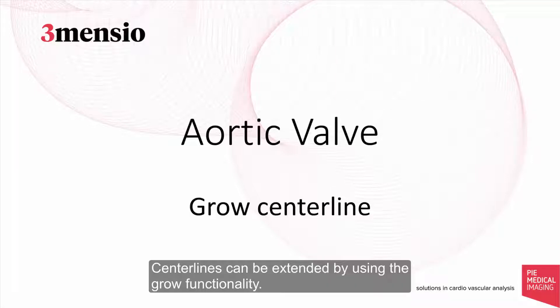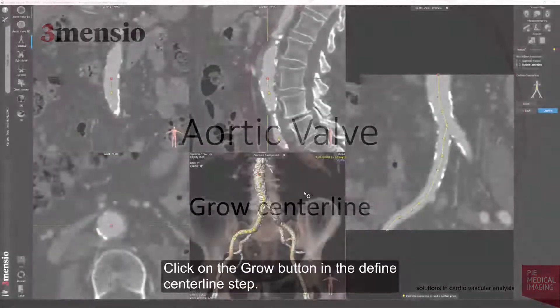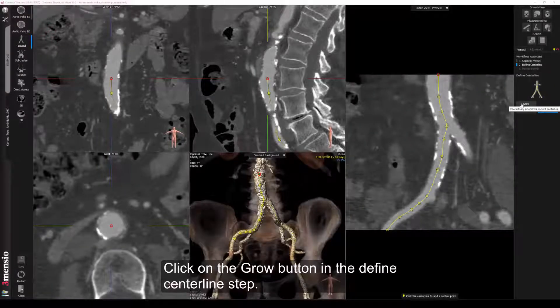Centerlines can be extended by using the grow functionality. Click on the grow button in the define centerline step.